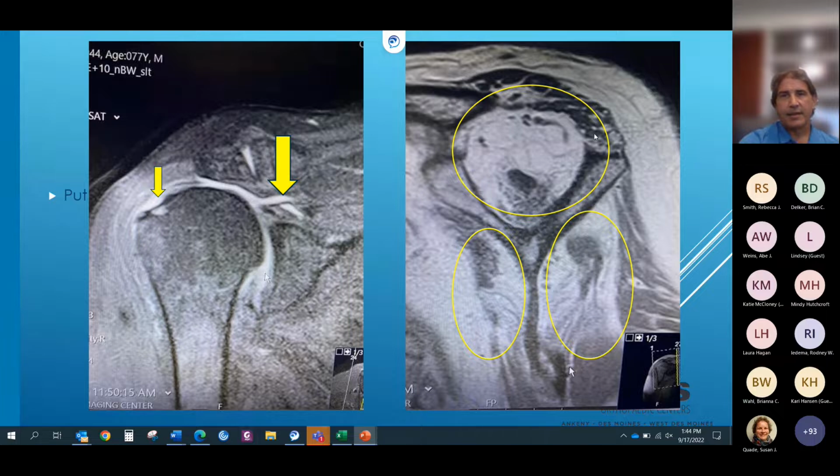The fat is light, and so what we see here is that all three muscles have really turned to fat, and that's what we call atrophy. This is what I'm looking at when I get an MRI, even if I know they've got a rotator cuff tear and I want to find out how old it is. Is it so bad that there's atrophy now in the shoulder?